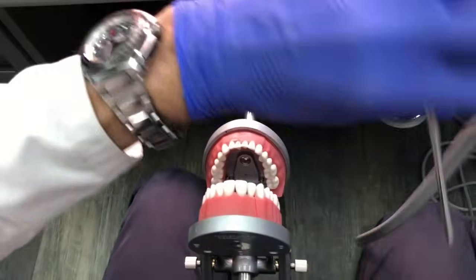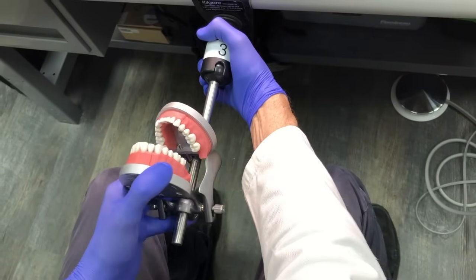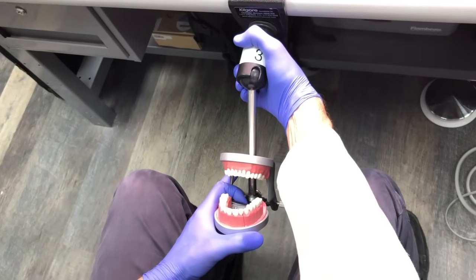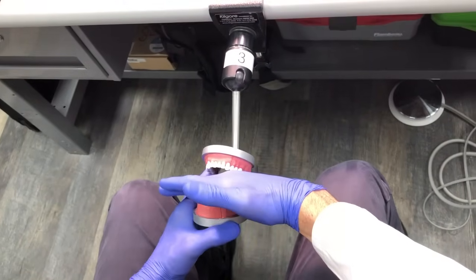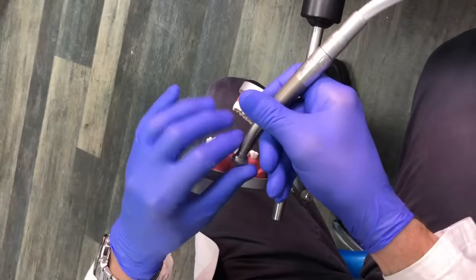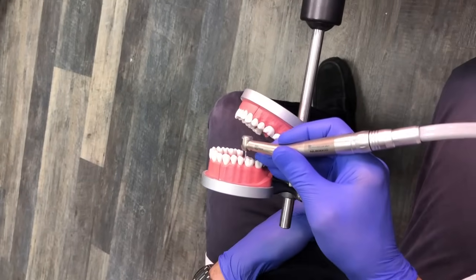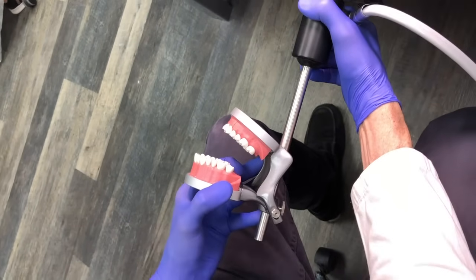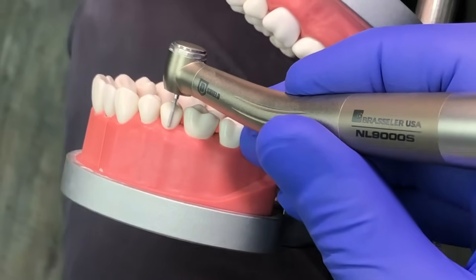When all lined up, left is left and right is right — but at an angle, you can really mess up your preparation. So that's one key hint: when using the handpiece and mirror, line them up. From 12 or 11 o'clock, you can have the patient turn left or right up to 45 degrees, but never let the occlusal plane go below perpendicular to the floor. Leaning just a little, I can see how I'm reducing the facial of the tooth, perform a Class 5 preparation, or see the bur passing through the interproximal.